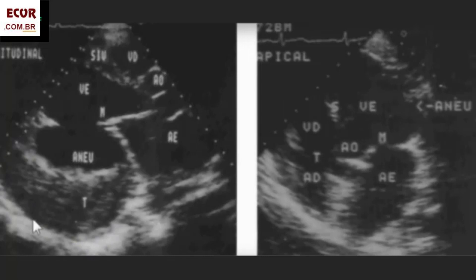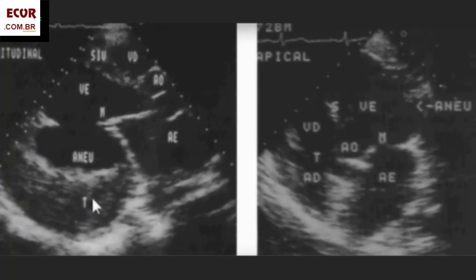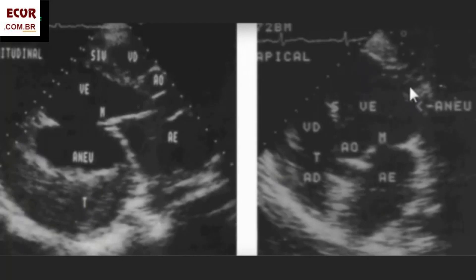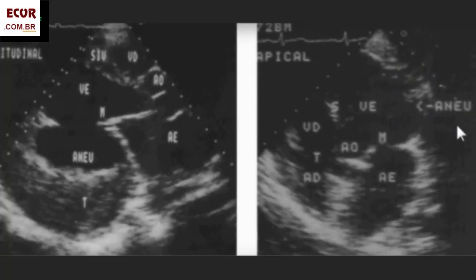It's a fibrotic wall. And you can see here the neck — it's a large neck. It can be in any place. This other patient here has an aneurysm in the lateral wall. And in the lateral wall, it was fibrotic also, and dyskinetic too. So — a perfect aneurysm of the lateral wall with a large neck.